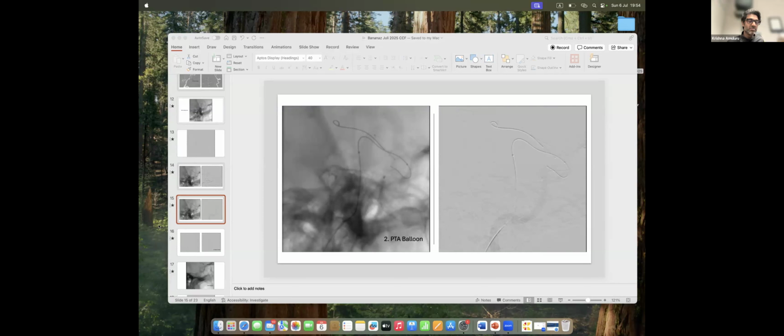Yeah, similar to balloon dilatation of flow diverting constructs, you try to get distal apposition first and then bring the balloon more proximally, right? That stent has to go somewhere, and in this case it seemed like it fell down. But fantastic save, pushing and bumping that second stent higher up. Really wonderful. Thank you so much.